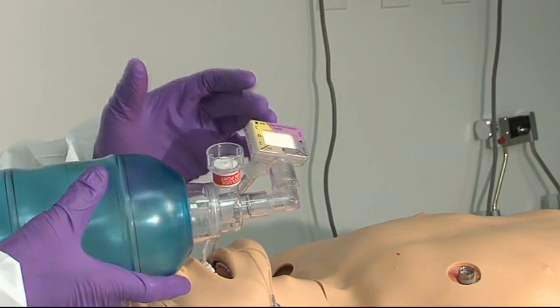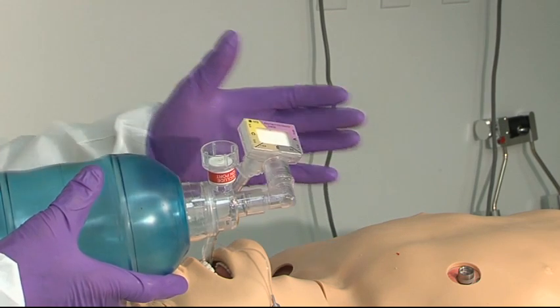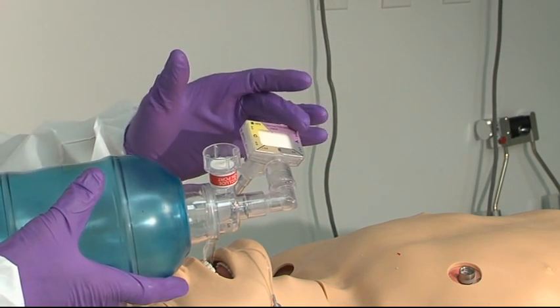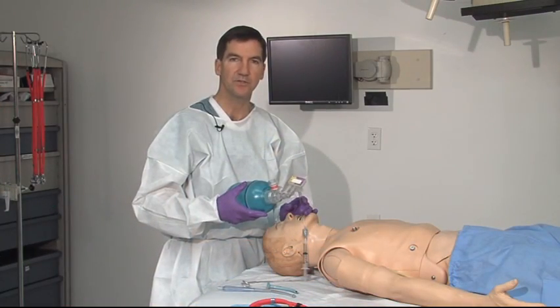Normally, the color is purple when it comes out of the bag, showing low CO2 concentrations. And you expect to see this change from purple to tan to yellow, letting you know that you have successful intubation.